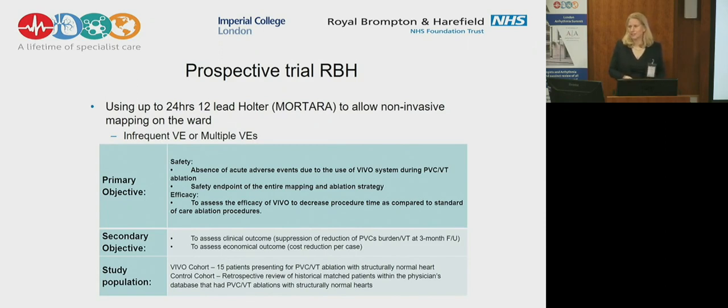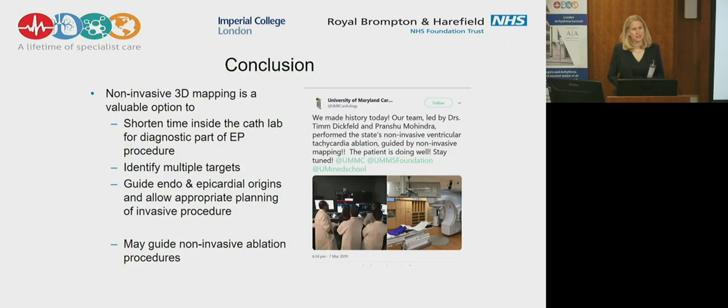That's basically what we have nearly the agreement from the local RSC for, and I thank Pat Kennedy for having gone with me to Guildford recently to have that assessed. We will then compare the clinical outcome with our database from patients that I've treated in the past with the same kind of substrate, and we hope that we will show that it's going to be much faster, and we will be able to treat far more ectopies in a shorter time, and show that it's beneficial. So let me conclude.